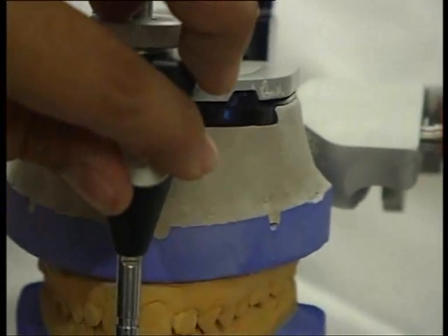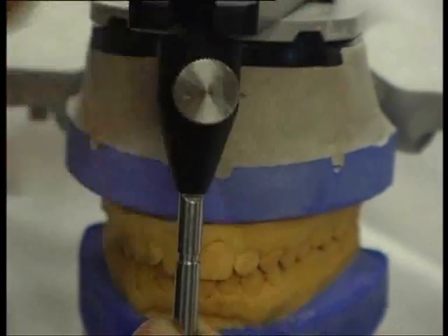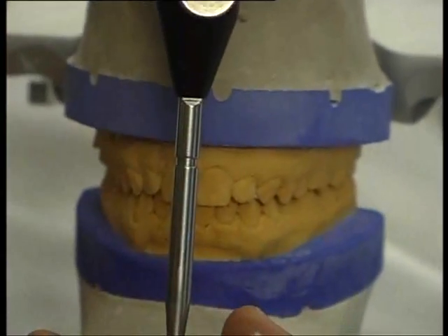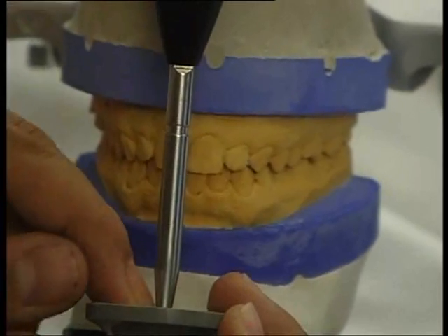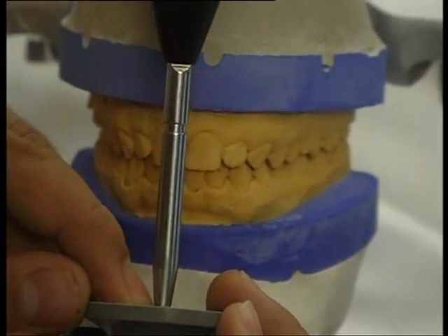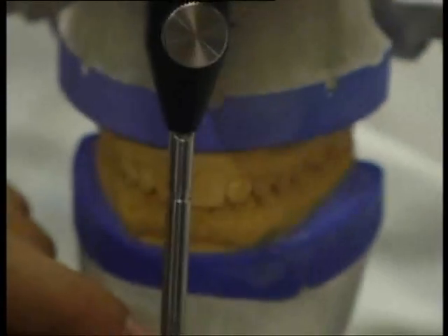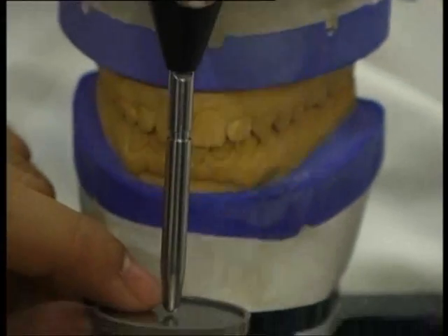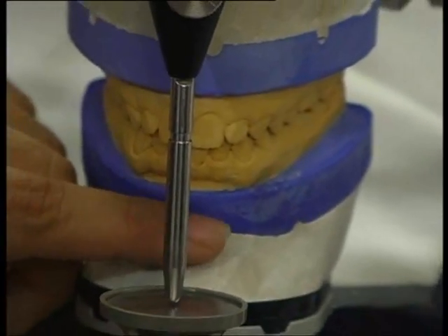The other way of measuring: wherever it closes — this is where it was tentatively closing, and I could see one mark. I will put some putty here and let that putty set, then take my caliper and measure the thickness of that putty at the deepest concavity. That is the amount I can add further in the vertical direction.